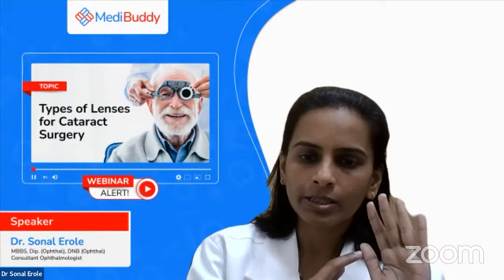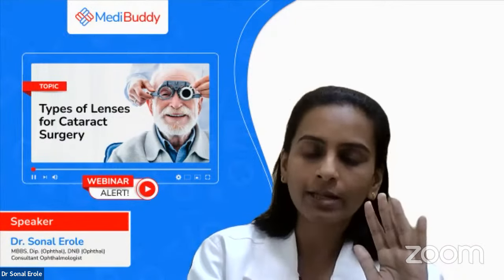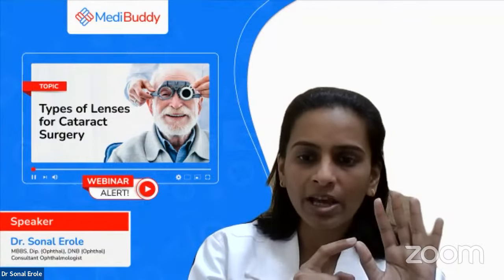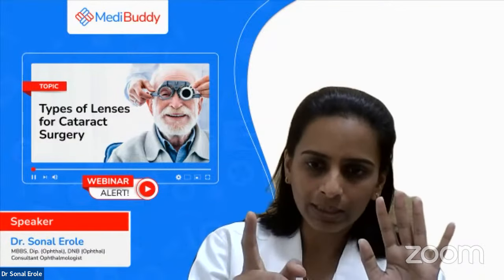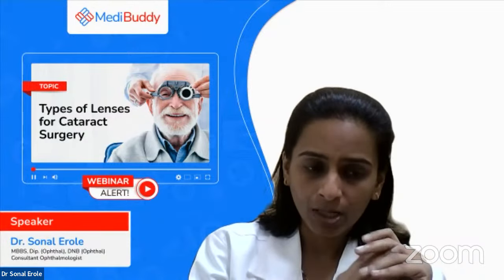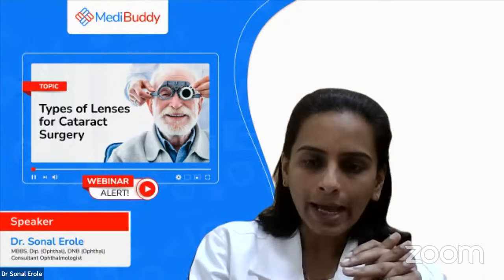Because your retina condition is not that good, but still if the patient insists or is okay with that, then we are okay with the multifocal lenses also. But if the patient is having a retina problem, then it is better to avoid multifocal lenses. They can go for good monofocal lenses and have glasses for the near vision. So these are a few points for the IOLs.